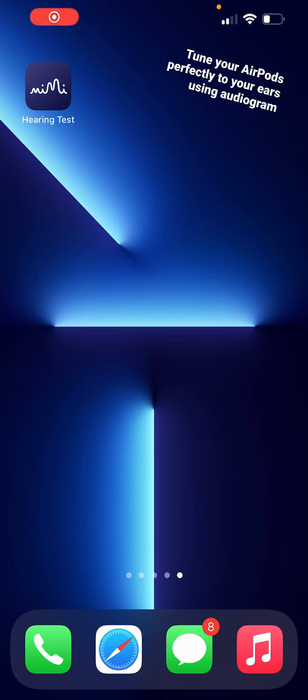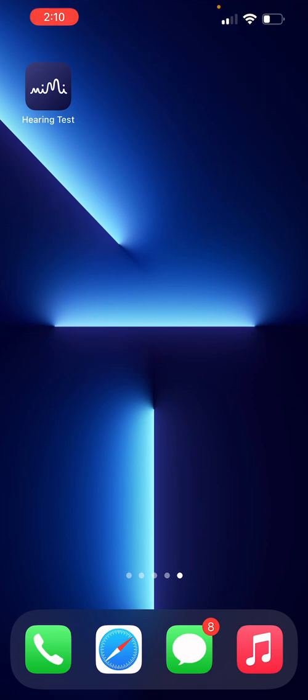This is how you tune your AirPods perfectly to your ears using an audiogram. First, you're going to download the Hearing Test app from the App Store.